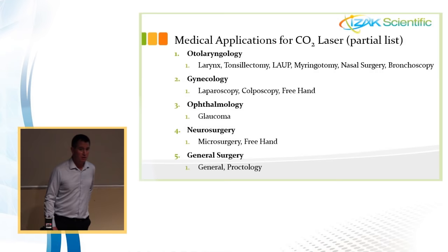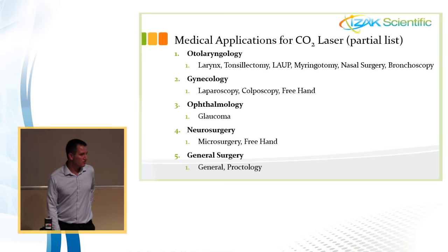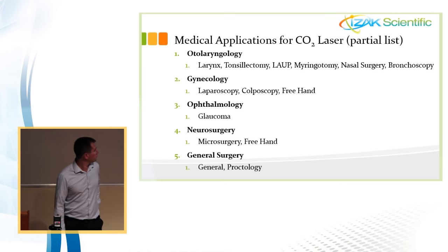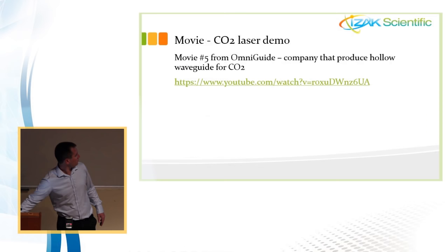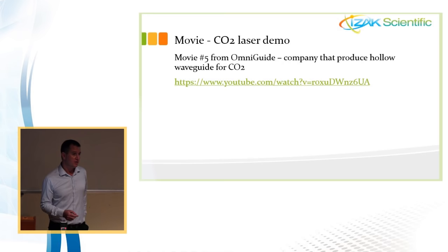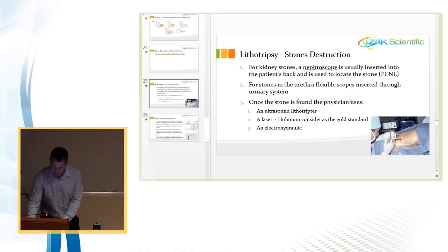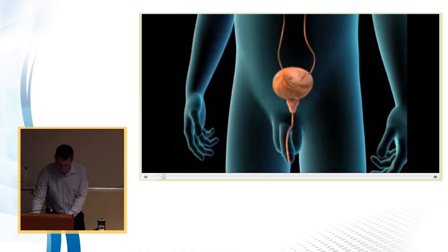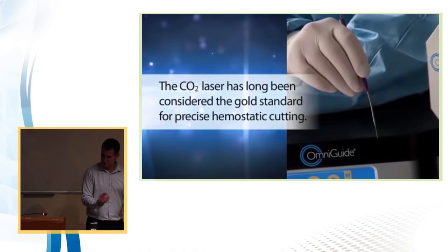Among the applications that use the CO2 laser, there are otolaryngology, gynecology, and ophthalmology. There is one company in Israel that works on ophthalmology for glaucoma, as well as neurosurgery and general surgery. It's also used with the robotic machine, the Da Vinci, that you probably heard about. And this is a short movie from a company called OmniGuide, the company that developed the waveguide. It will wrap up this laser tissue interaction with some applications. Here you see the waveguide, with a handpiece very similar to the tools that surgeons use to work.